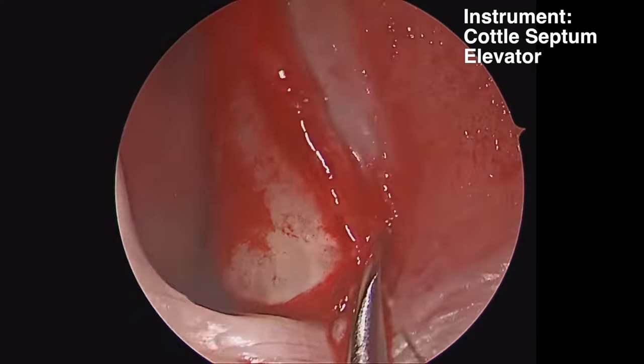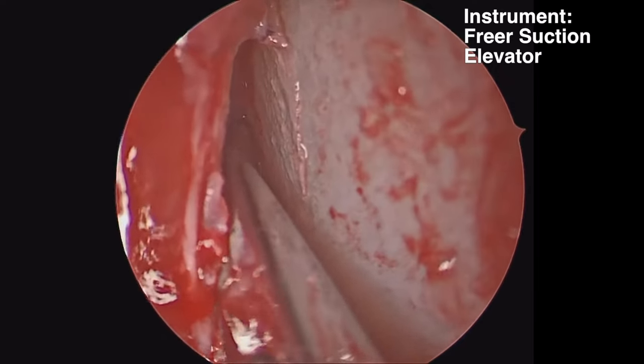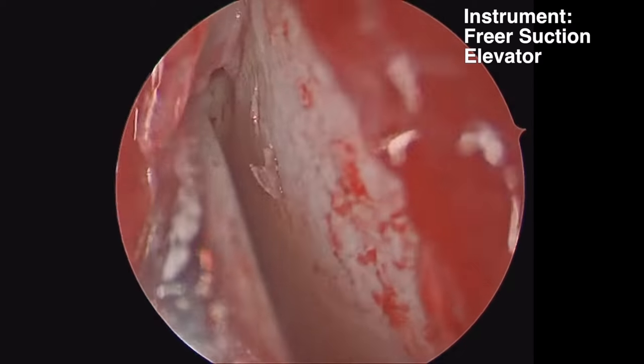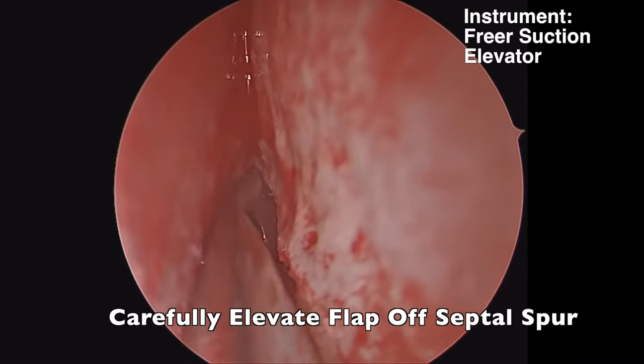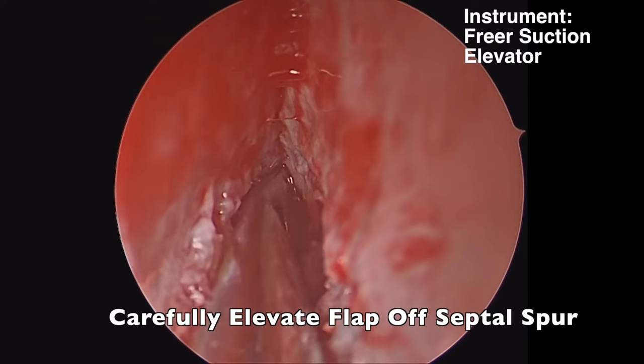We want to get down to the perichondrium and elevate the perichondrium off the septal cartilage. We're using a suction freer, which allows us to suction while we're using the endoscope under our mucosal flap.